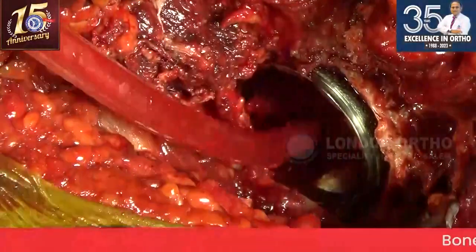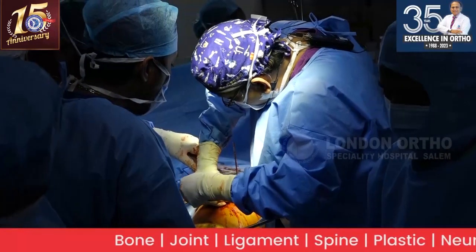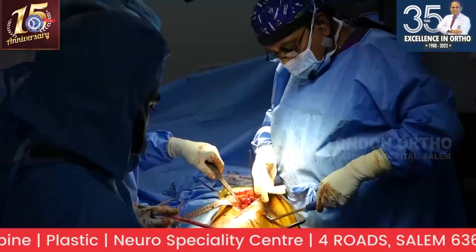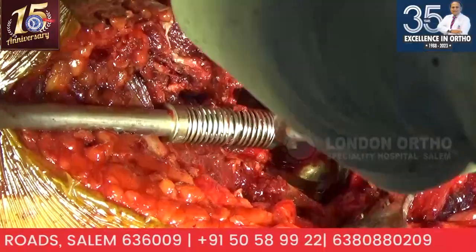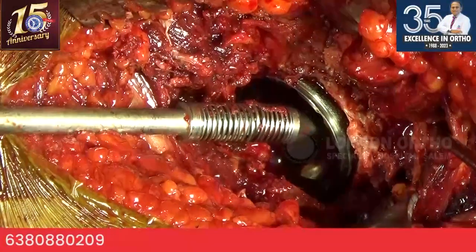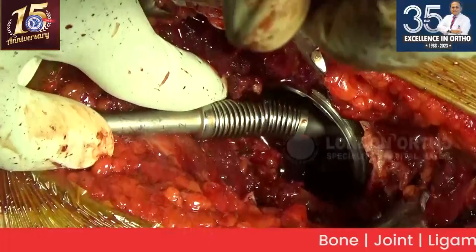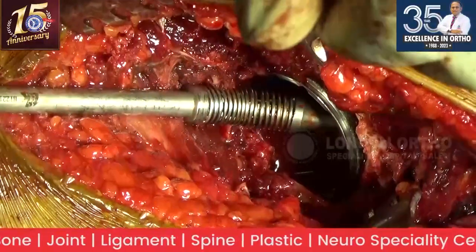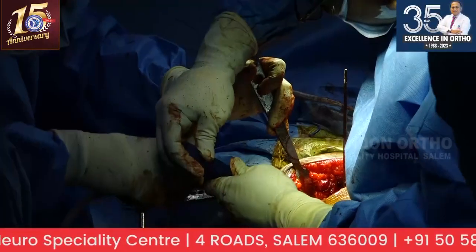It is not in the right direction. Sir, a question to the chairpersons. Yes, sir. This being a dysplastic case, we understand that he has difficulty in placing the cup on the first instance. So we have screwed it, taken it out, and again we are going in. For a regular case, if the cup is not going in, would you take it out and do it again, or how would you do it? What precaution would you take? Basically, the cup has to sit snug fit. If it is not, you can't just rely on screws alone. So you reduce the size of the reamer by 2 millimeter, deepen it if possible, and make sure the cup is stable anteroposteriorly or supero-inferiorly, at least in one dimension. It has to fit.